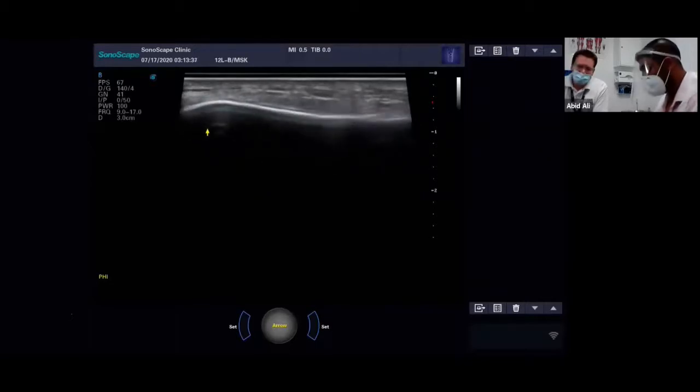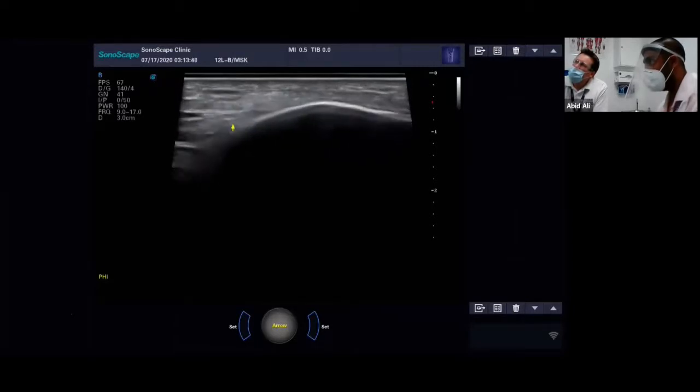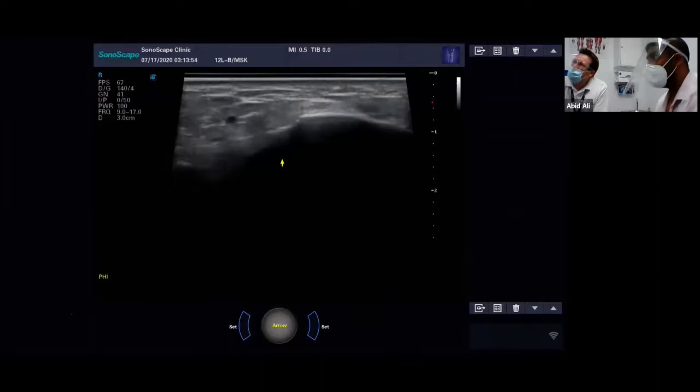So of course, I like to start this in the long axis, just because I like to pick up the ankle mortise first of all. So you can see now there's a drop, a little step appearing. And I'm going to keep following that. We've come to the end of the tibia. A bit more jelly. Come to the end of the tibia.